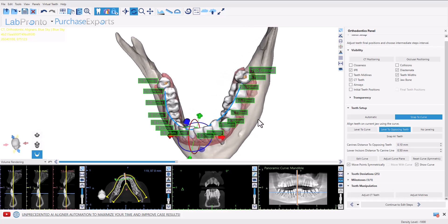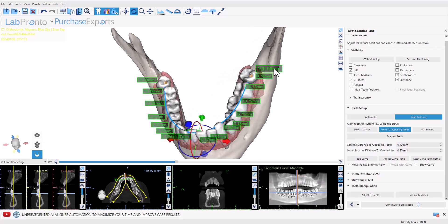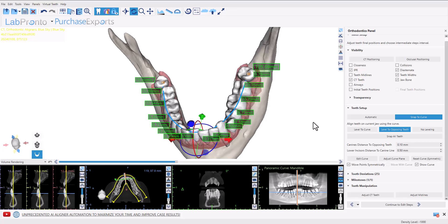The total length of the arch, as a sum of each individual tooth, is visible as well at the end of the arch. If you would like to measure the length of the arch with the curve in different positions, this can be done as well.